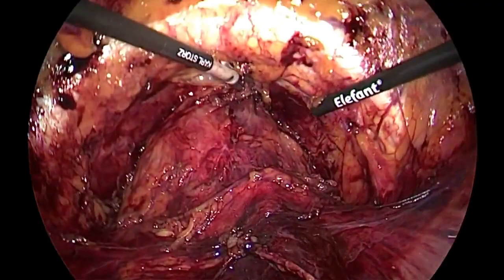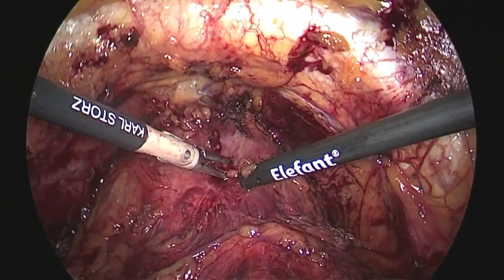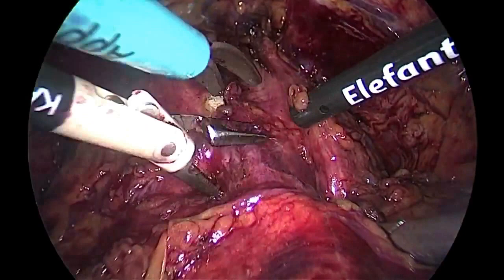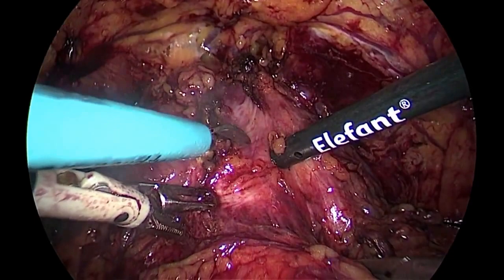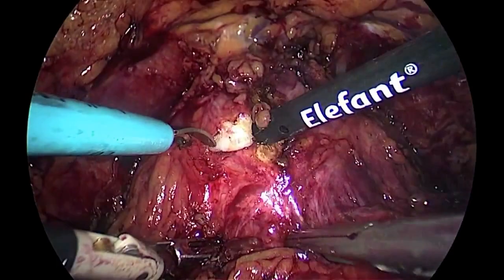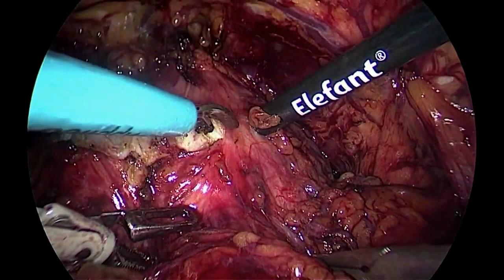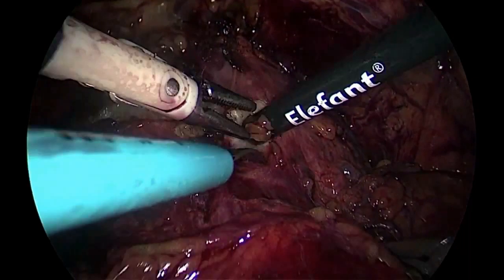Can you hear me? Coagulation. Bleeding. And monopolar. Okay, monopolar. Step by step, slowly. As you can see, the incision is performed. Coagulation. Okay, again. The right side. Coagulation. Bipolar, please.